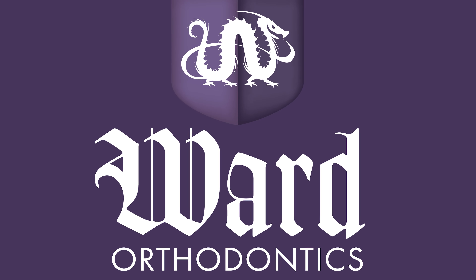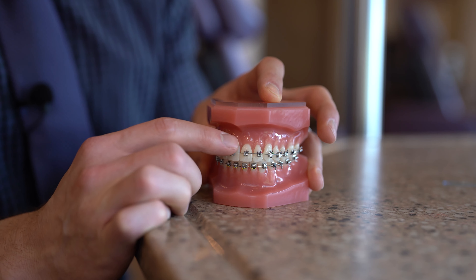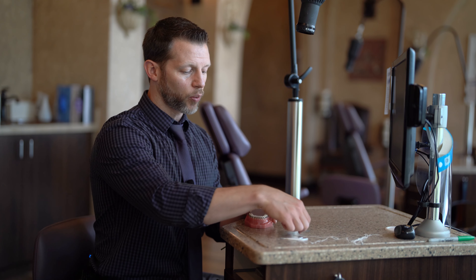Hey, it's Dr. Ward. Today I'm going to be showing you how to floss with braces. Anytime you're flossing, it's really important that you floss all the way to the gum line. That's where plaque tends to collect and it tends to cause inflammation in the gum tissue. When you floss with normal floss, it's difficult to do that with braces because there's a wire that blocks the floss from going all the way up to the gum line. So I'm going to show you a few different ways to get the floss underneath that wire.